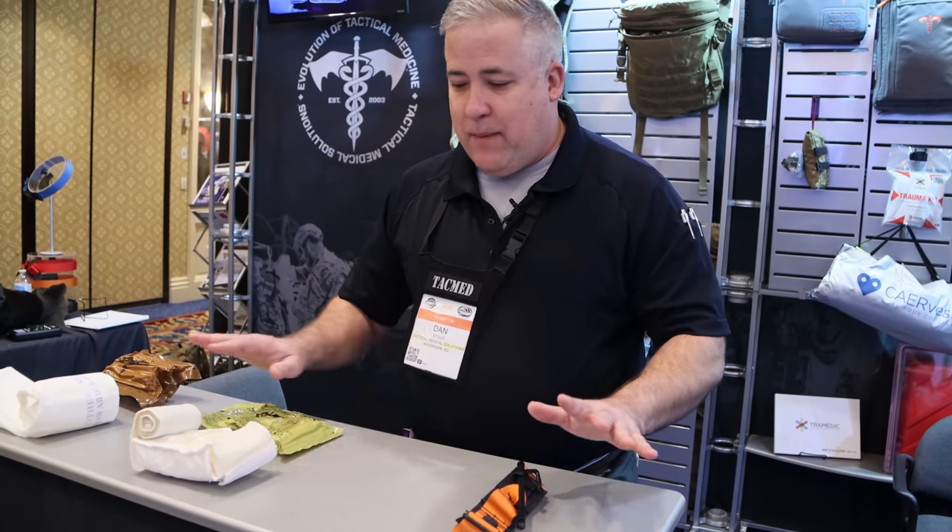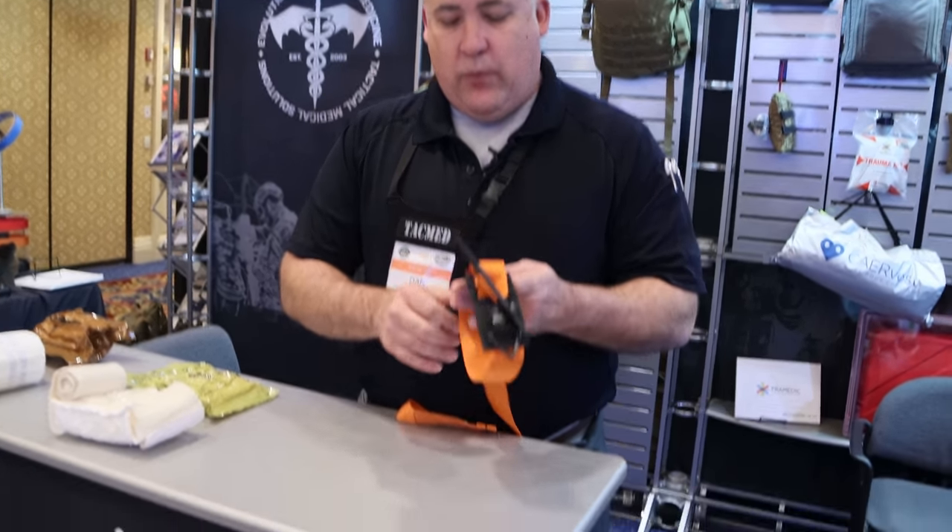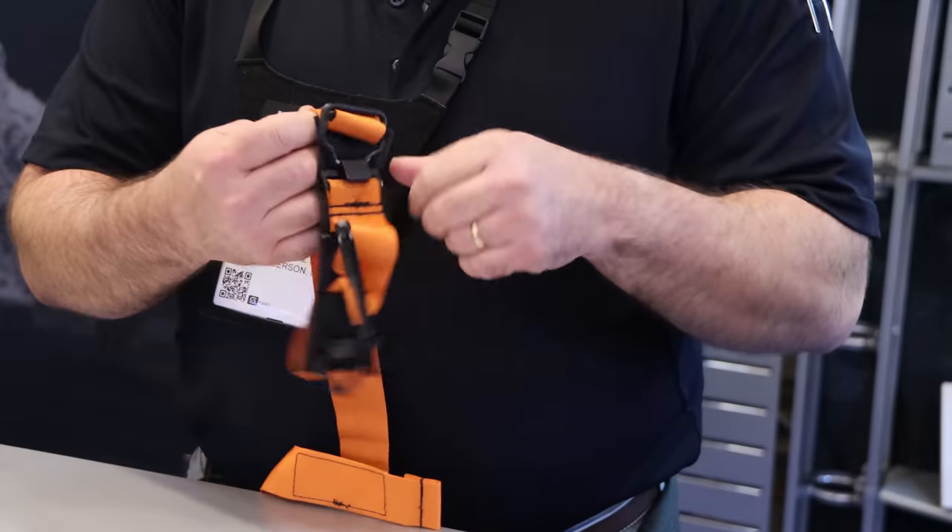All right guys, we're back. Just a couple of examples of some of our main components that we carry in our kits. We are the manufacturers of the Special Operations Forces tourniquet, and we are on the Gen 4 of the tourniquet.